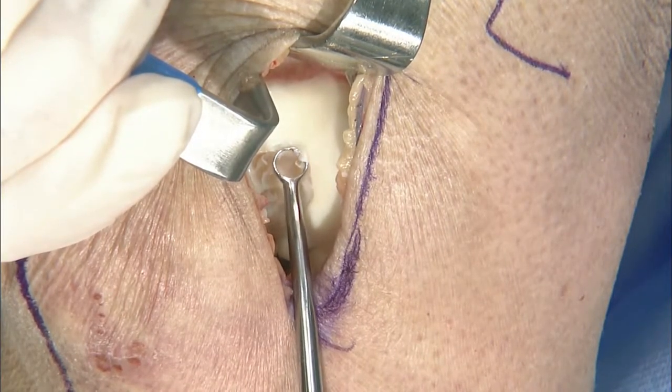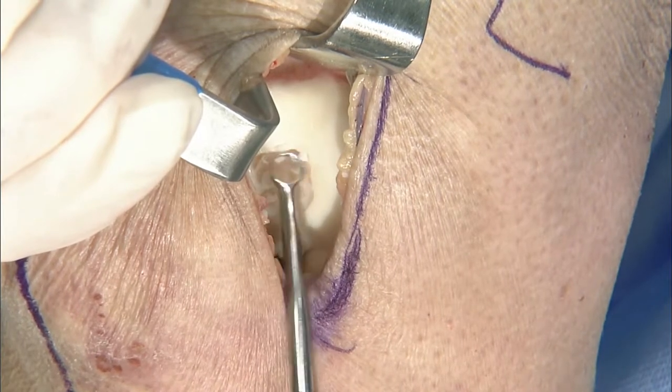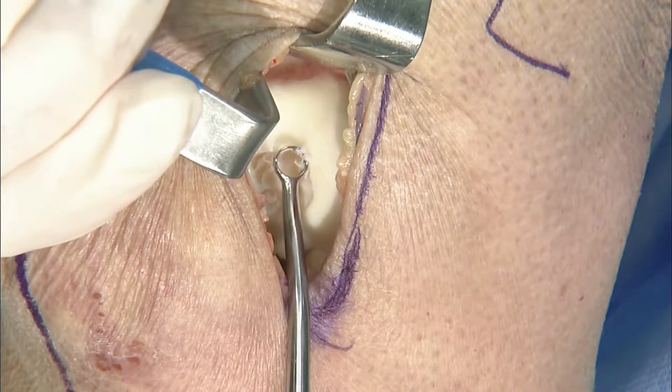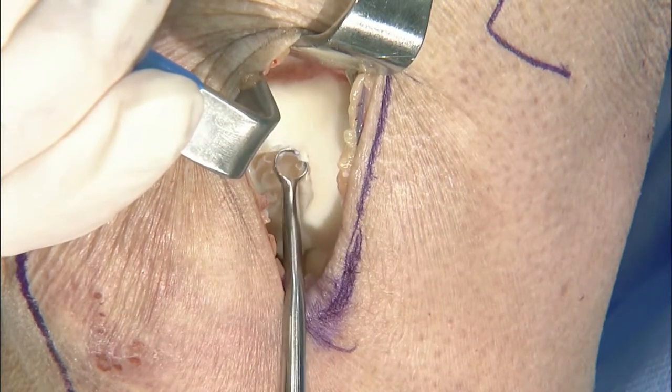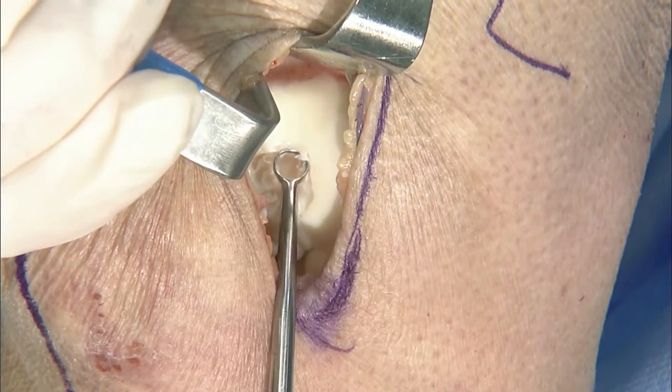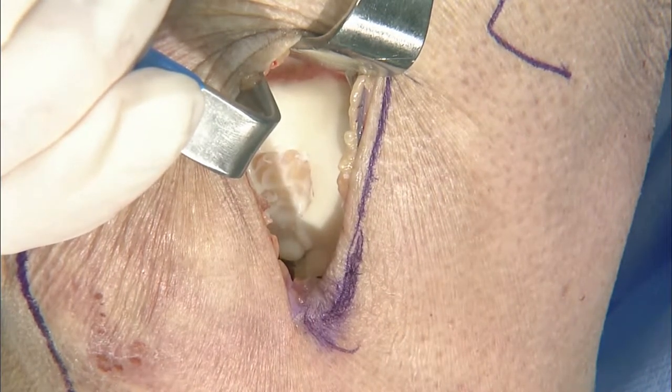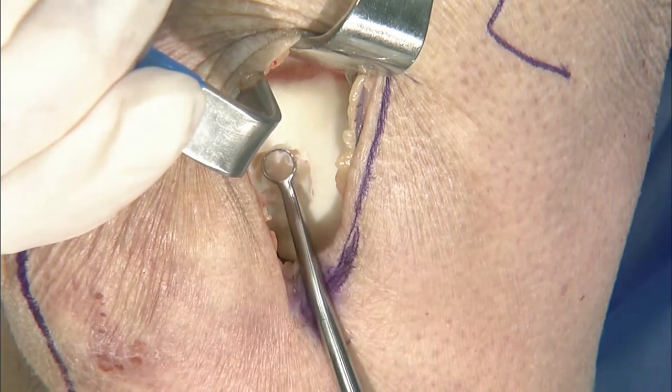That's very different than if I push here and there's almost complete delamination of that cartilage there. That I will start to take, even if the cartilage looks a little bit better. So to me, that subchondral attachment and the health of that subchondral bone in that area is a pretty important thing that I look at. Yeah, I agree. That's crucial.